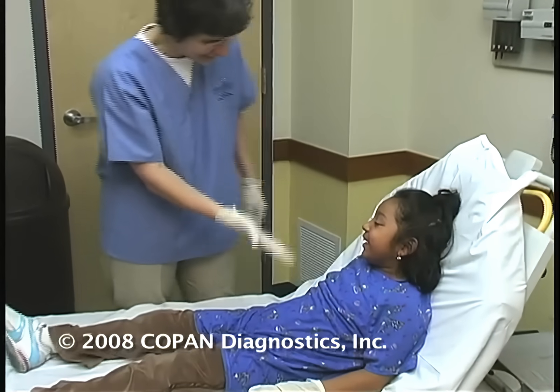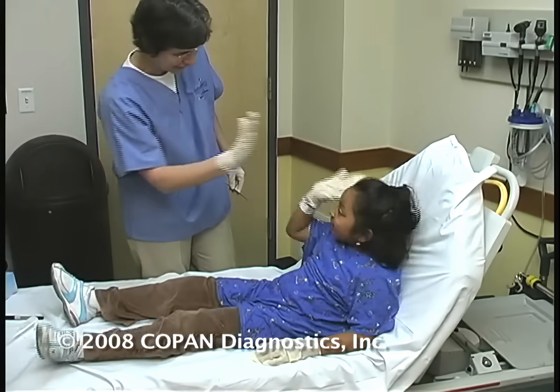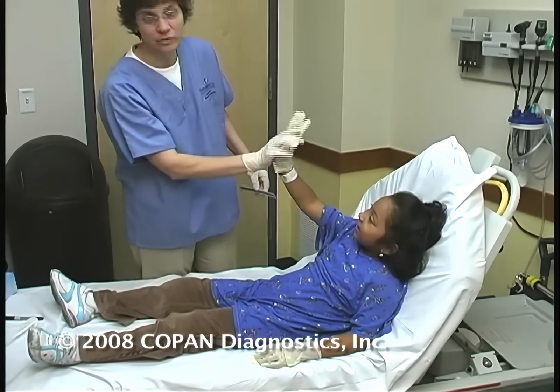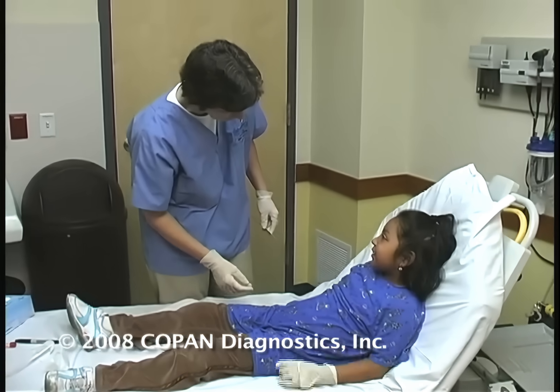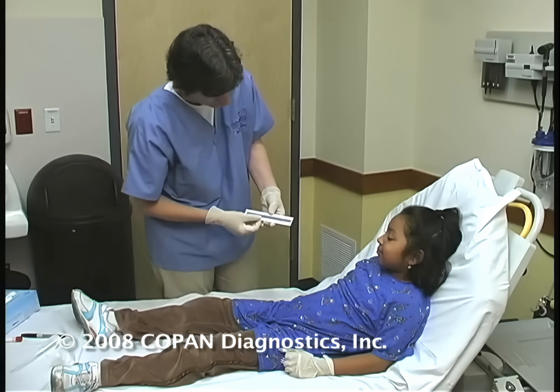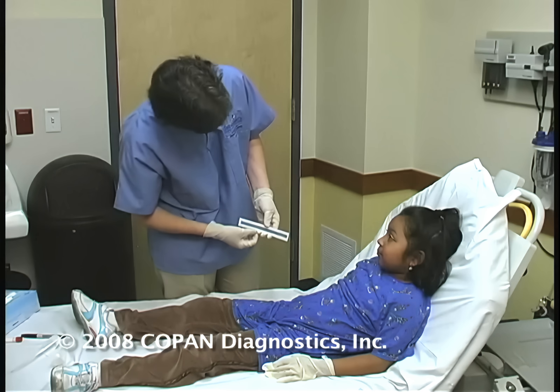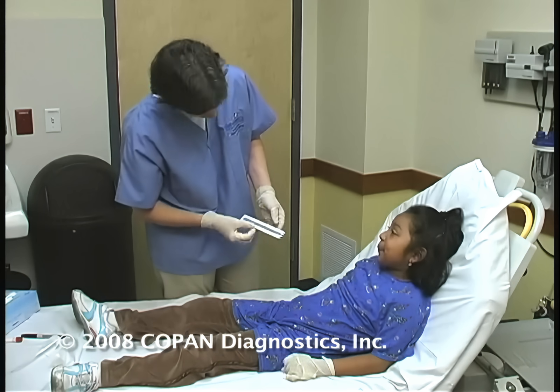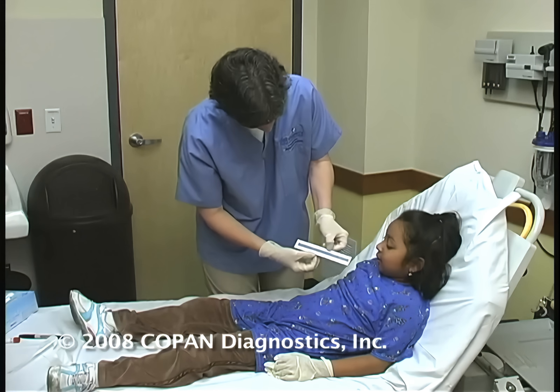This is my friend Yadira. She is six years old. She's here today because she has a fever and some coughing and just doesn't feel good. Well, we're going to get a little quick swab from Yadira — we're going to test her for flu, and she's going to let us show you how to do this the best.